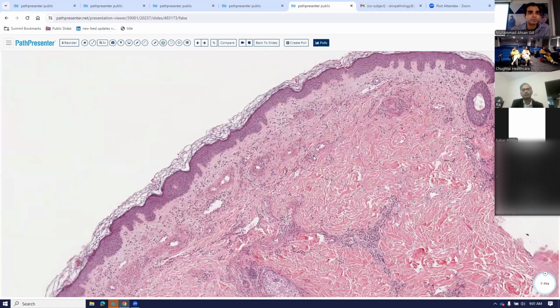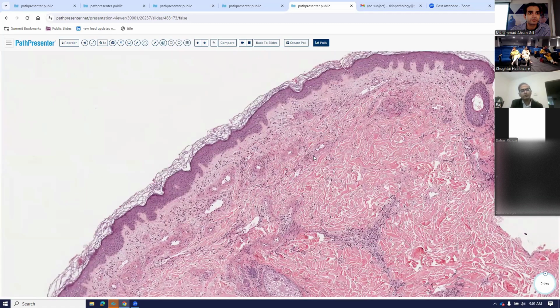And again, like spongiosis, leukocytoclastic vasculitis can be caused by many different things. So you do not have to try to find the root cause. All you're going to say is this is compatible with leukocytoclastic vasculitis, and then leave it to the clinician to decide whether this is associated with a drug, with connective tissue disease, or with some kind of an iatrogenic cause. The clinician will decide, but it is important for you to tell them that this is some kind of a vasculitis, because then they will definitely treat the patient in a very acute manner.